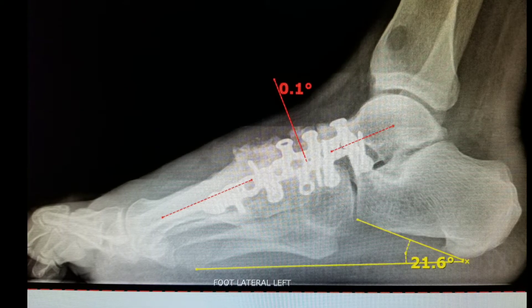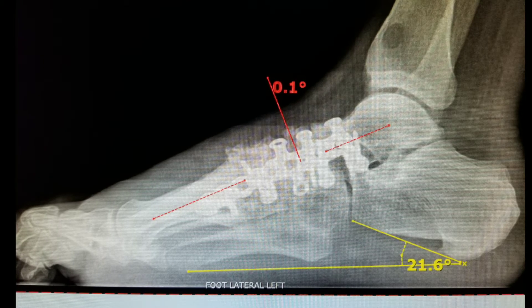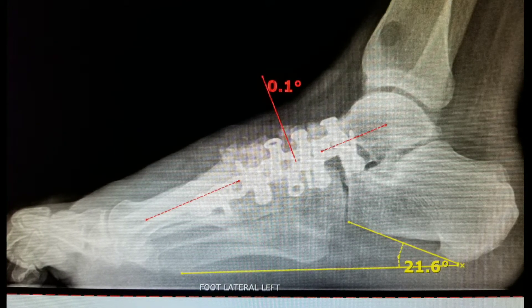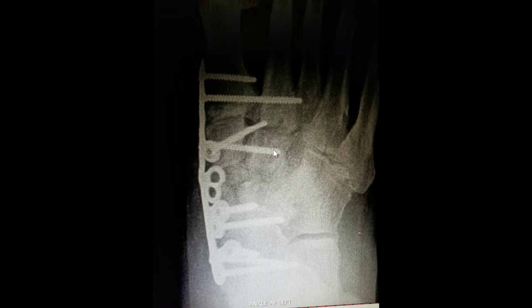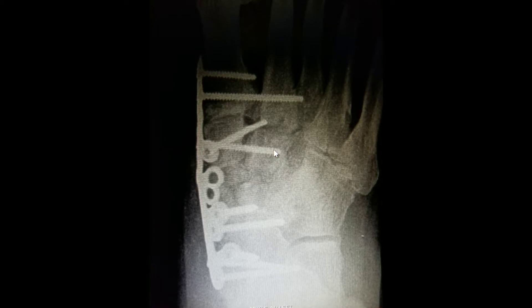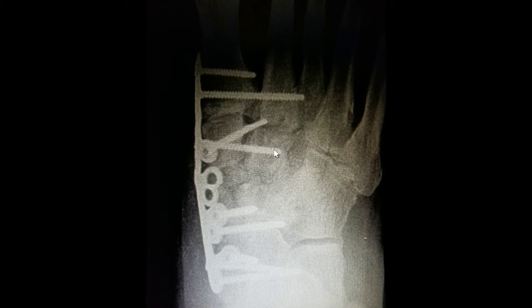You also have to take some bone graft from the distal portion of the tibia, as you can see that little hole on the top of the bottom of the tibia. The screw fixation needs to be robust — this is called a superconstruct. As you can see, there are multiple screws going through the foot, but there's a beautiful fusion site filled in with some great bone graft.